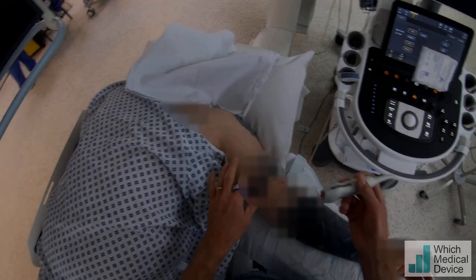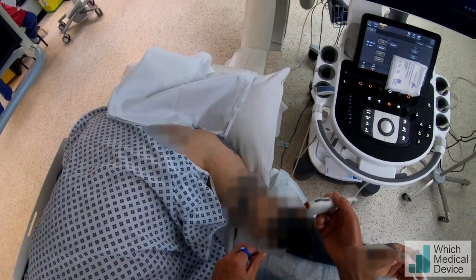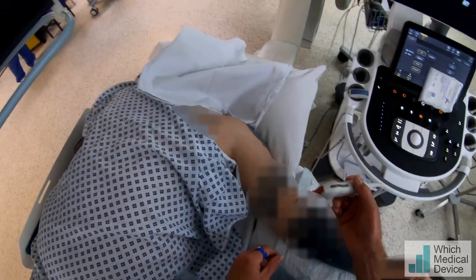This gentleman has a brachial dialysis fistula and he's got raised venous pressures on dialysis, so we suspect he's got a recurrent stenosis at the cephalic arch.